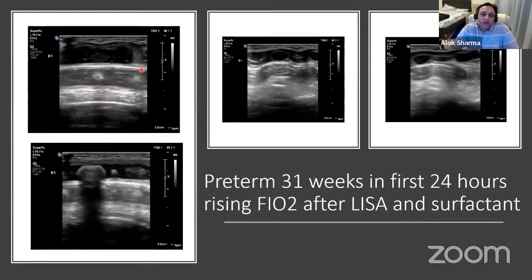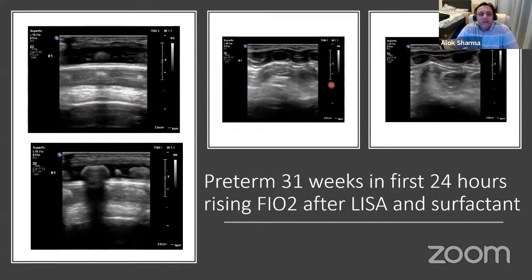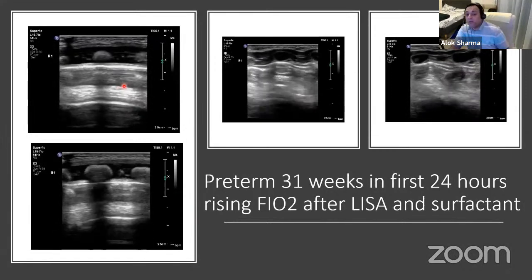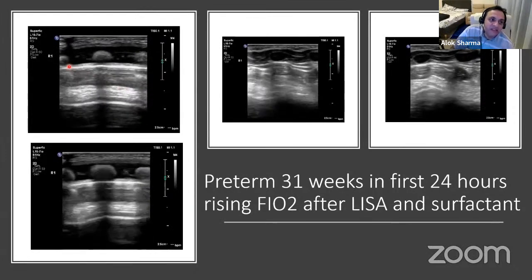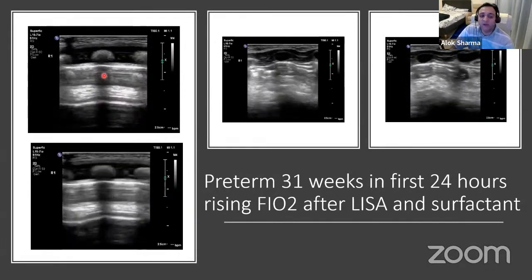I really worry about that pleural line over there and whether you're really sliding. At the moment I'm certainly not sliding, and this is what you should be seeing in terms of the shimmering. I can see a baby that's breathing. The reason I'm struggling at this point is I'm using the hockey stick, so I'm getting a very small footprint. Not only that, I've got my gain settings turned up big time, so my dynamic gain is really high. For that reason, it's exaggerating everything. You can see that the acoustic shadow behind the ribs is looking bright.